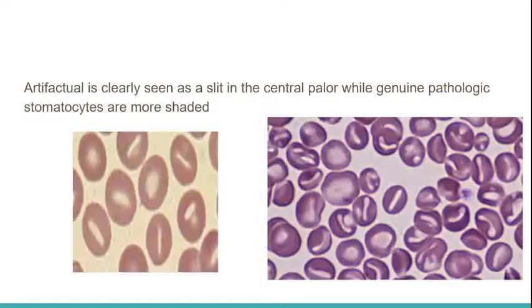This one is from our archives, and this one is taken from labreview.com. I do not take full responsibility for this photo, so I don't want to be copyrighted. Okay. Now let's look at the artifactual one clearly.